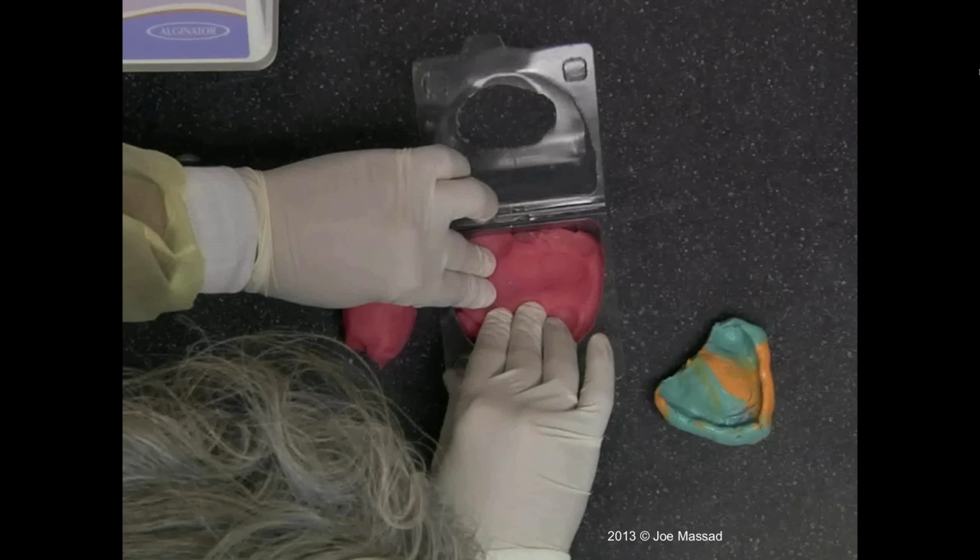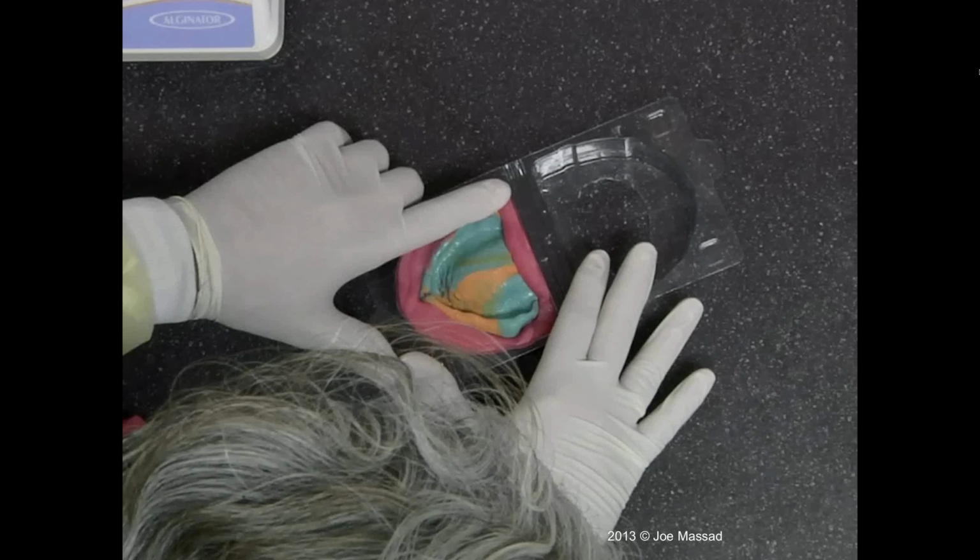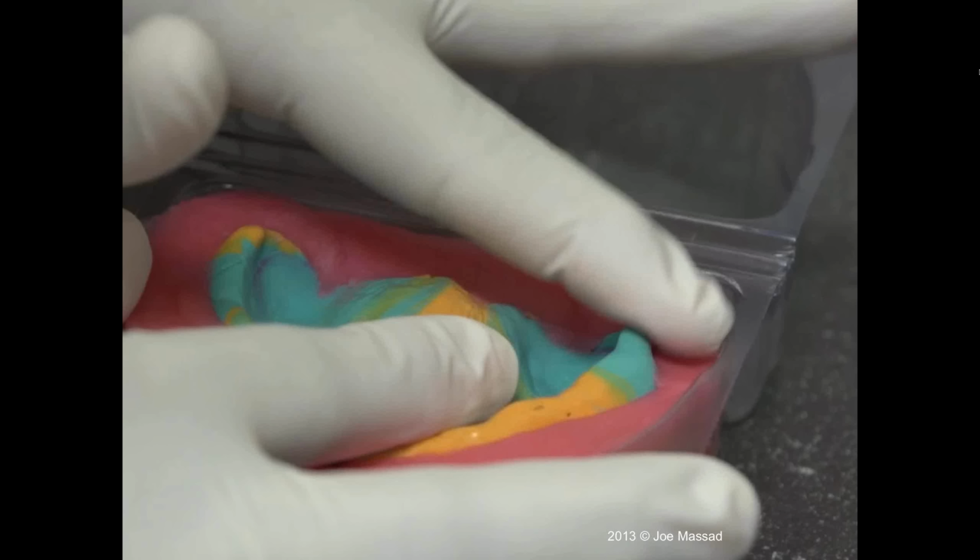Now, what do we actually need for the peripheral anatomy? The peripheral anatomy is extremely important in any detachable prosthetic. This is the part that seals it. This is the part where we get retentive area. So the height, if you take a close look at the edge of the border, we only want to go approximately 2 millimeters. Roll it to the labial buckle. That's it. You don't need anything else exposed. And you can go all the way back to the postpalatal zone, which is important that we identify that also.